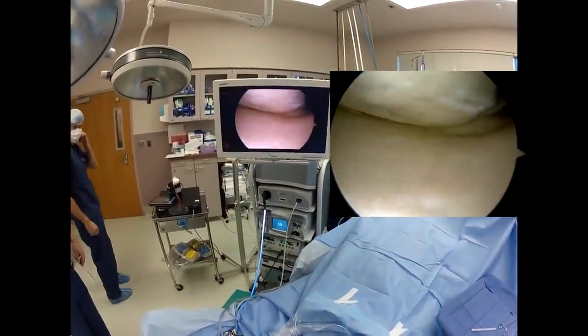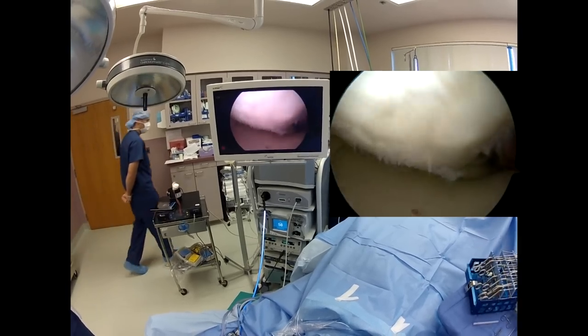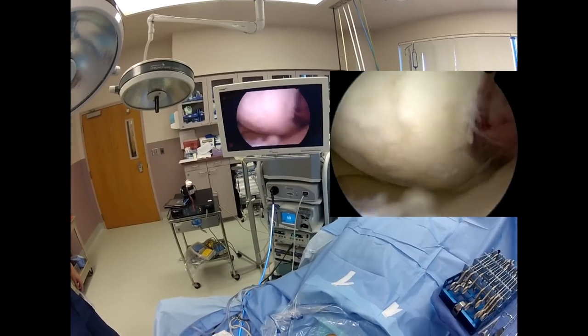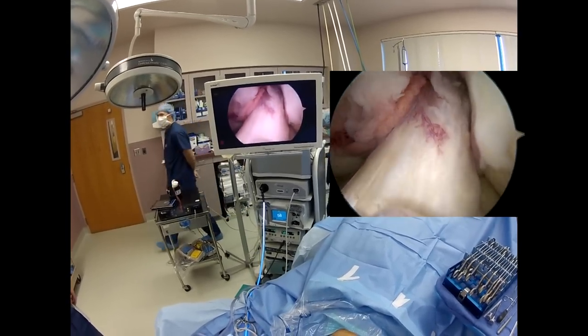Right here you can see the chondromalacia and the meniscus tear. She's got some pretty good chondromalacia, some synovitis. The ACL looks nice and intact.